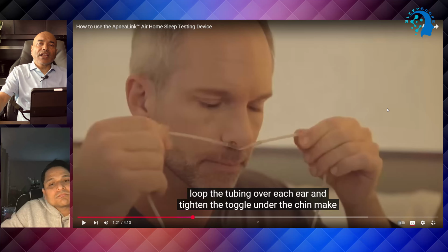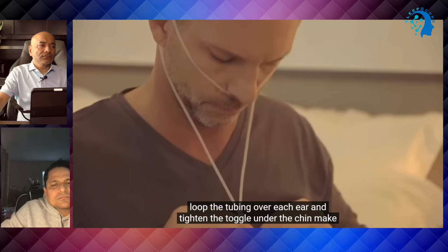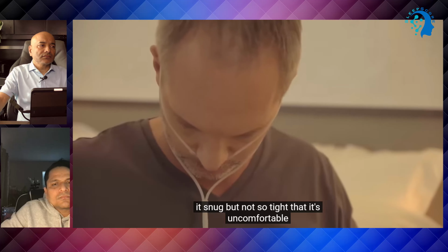So this is called a nasal cannula, okay? The nasal cannula goes to the nose and monitors the breathing with the help of air pressure. Loop the tubing over each ear and tighten the toggle under the chin. Make it snug, but not so tight that it's uncomfortable.